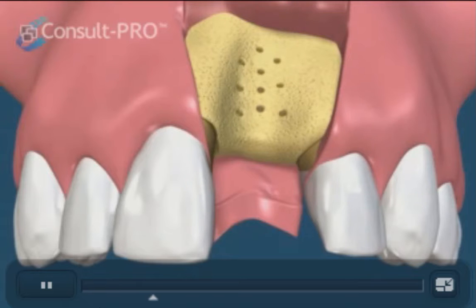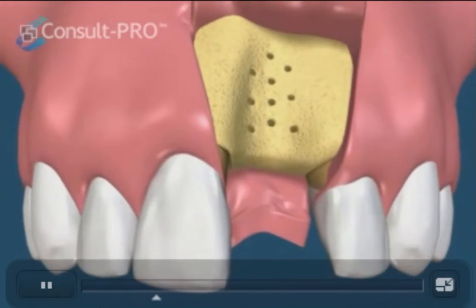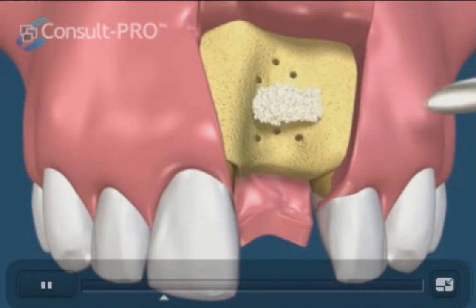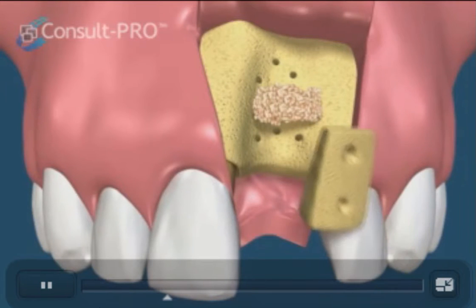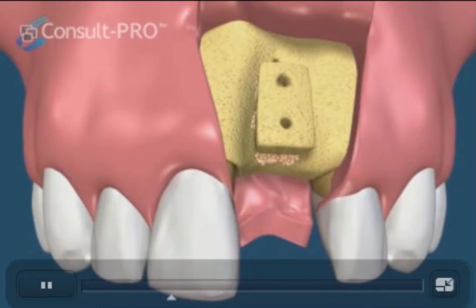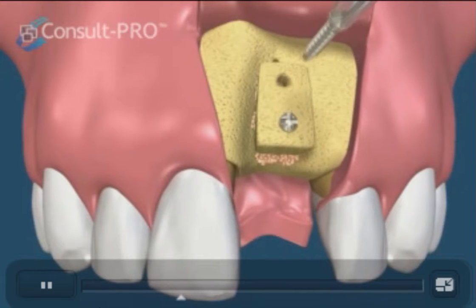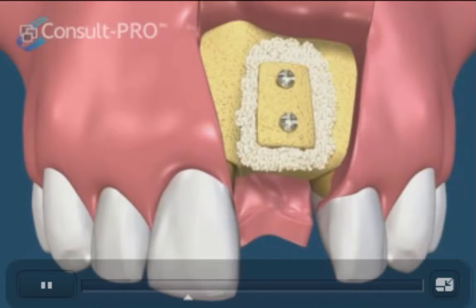We can place some allograft in the area and then secure a bone block graft with two bone screws. These screws hold the graft in place and will be removed later. Any voids can then be filled with the same allograft, and blood will soak the graft and begin the healing process.